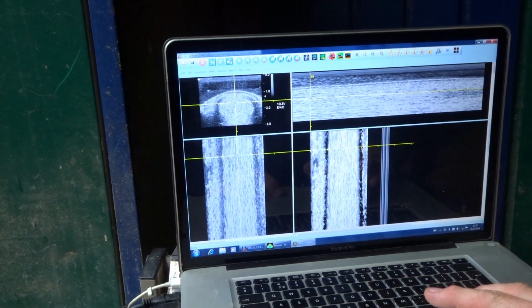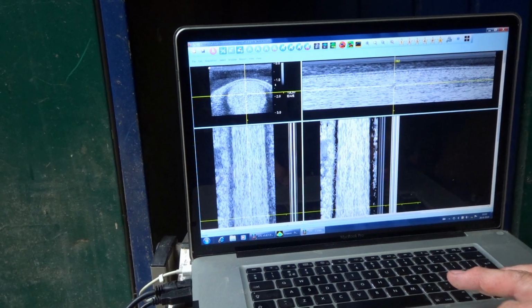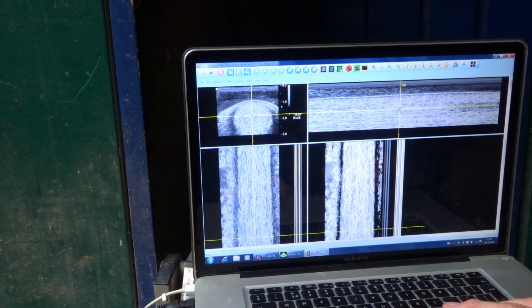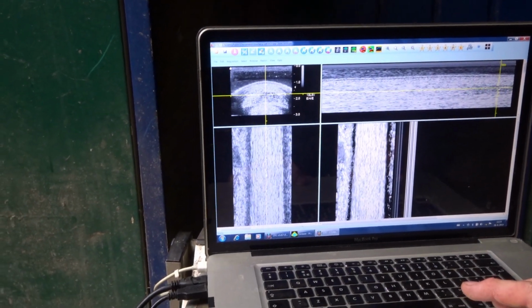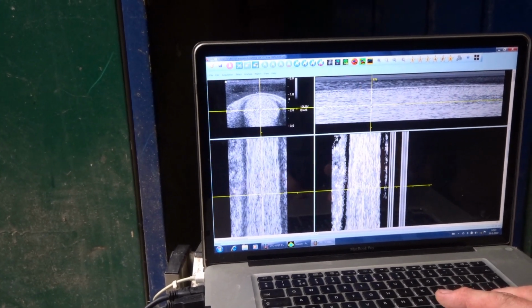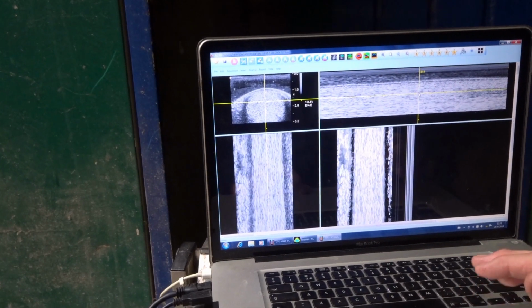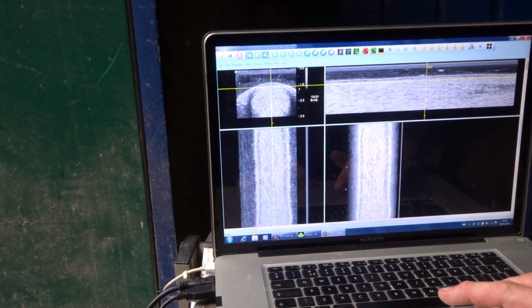I can start at the top of the tendon and basically pick any spot where I want to know more. Now you can see here there's an area of interest because it's abnormal in its color, and I can pick that area out. But I can also see that at the top of the tendon there's less. There are some shadows there, but to see the whole tendon in one image is, I think, a very useful tool.